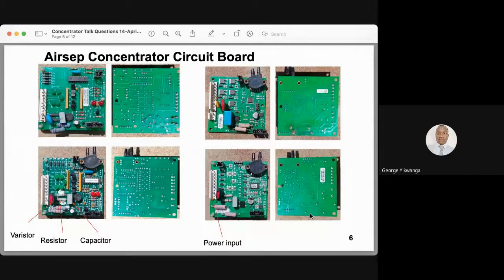There's the LF, that's left feed, for the solenoid valve for left feeding. And there's RF, that's right feed, the solenoid valve for right feeding, and right waste for right waste. All these labels you can see on the PCB.